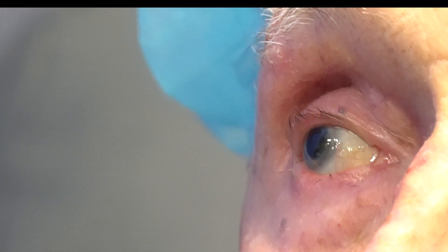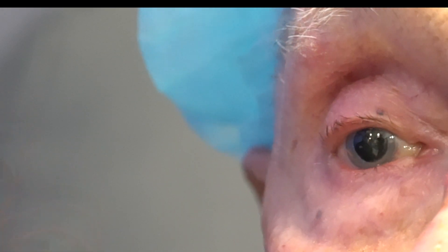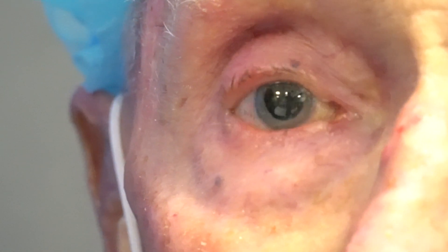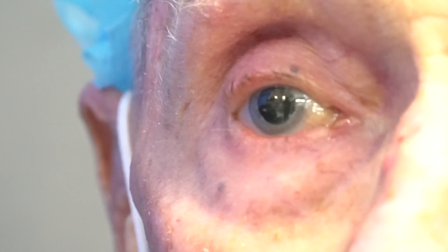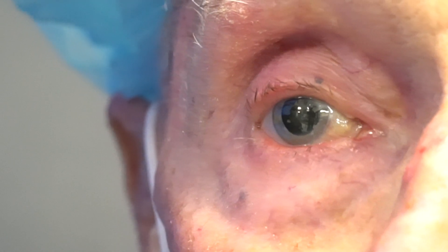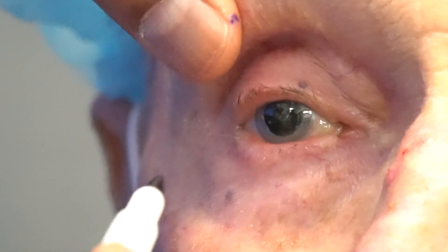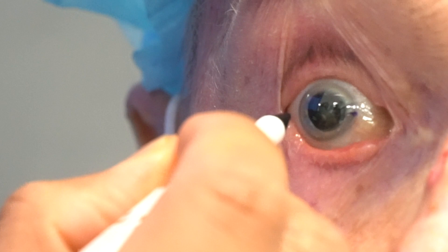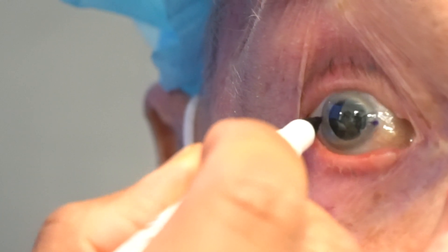This is another marking in the eye for a toric lens. I get the patient to keep their head and body nice and neutral, looking straight ahead at a place on the wall, and all I have to do is mark zero and 180. You don't want to do this with the patient lying down, because then the axis of the eye changes subtly. So again — little finger opening up the lower lid, thumb opening up the top lid — and then just put a mark medially and laterally. That allows them to align the lens.